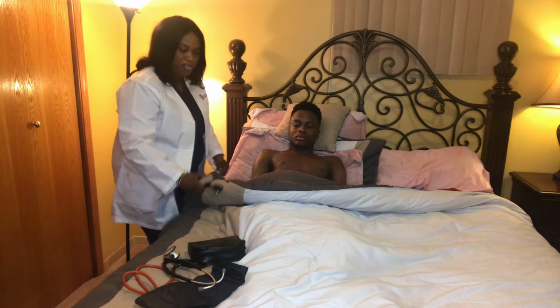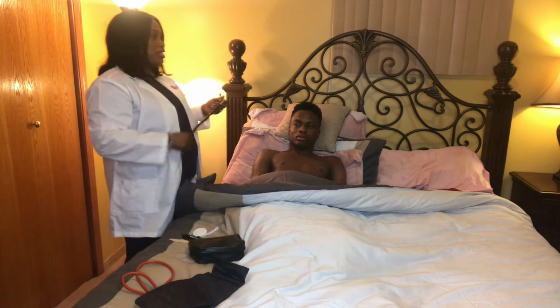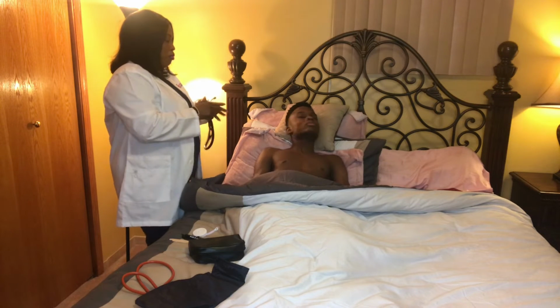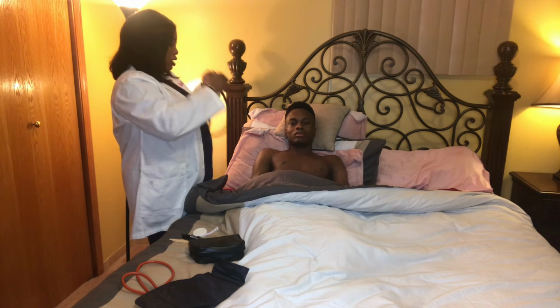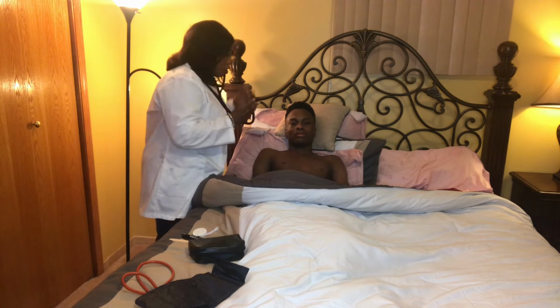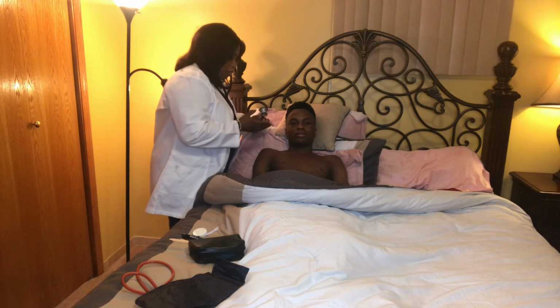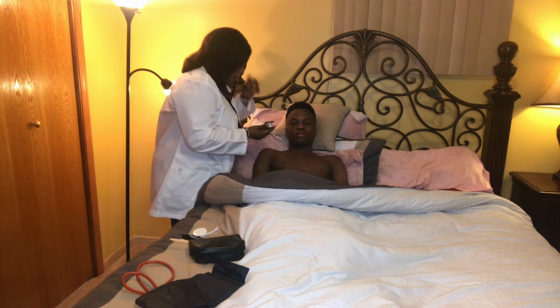Now that I've palpated, I'm going to auscultate the carotid pulse. I'm going to use the diaphragm, and also the bell of my stethoscope.